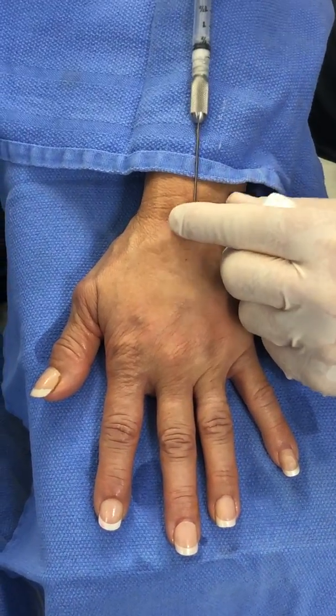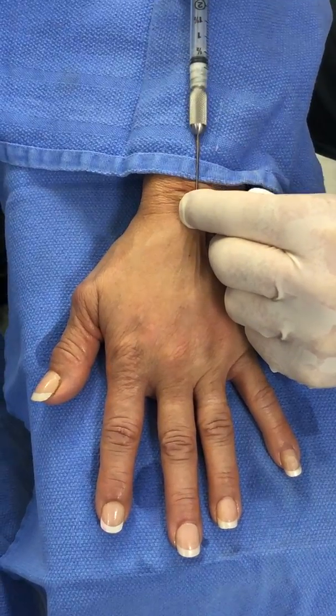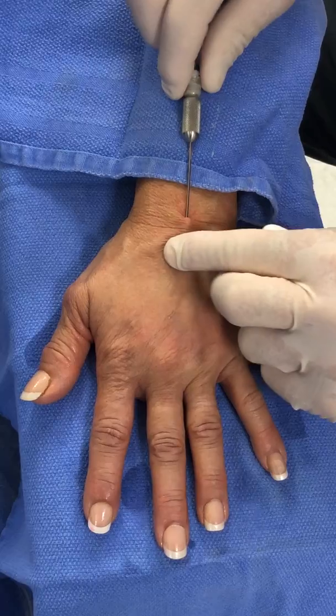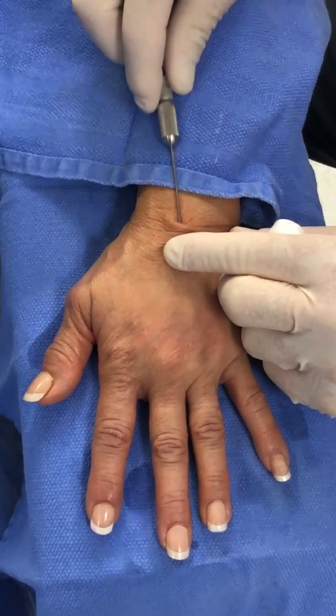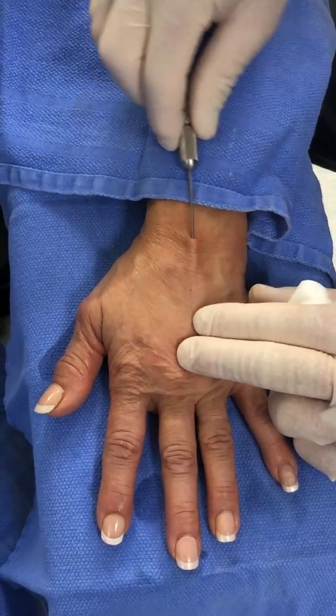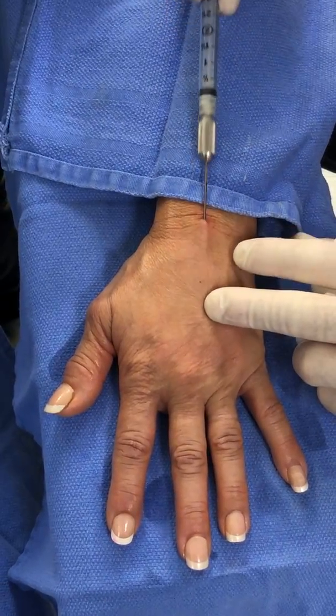That hand looks really great. I've tried 1.5 cc's per hand and it doesn't work nearly as well — you will not get the result. You really have to put in 5 cc per dorsal hand to get a result.